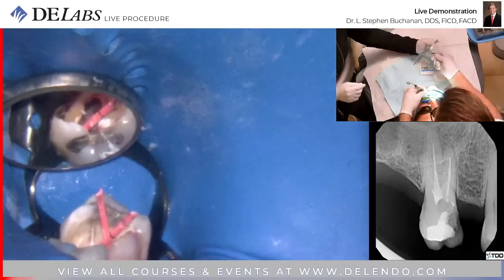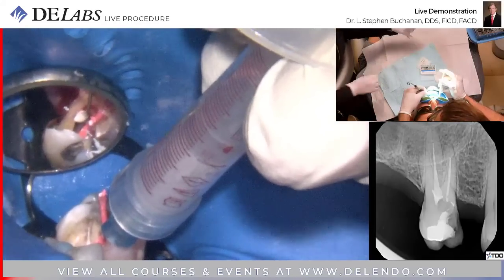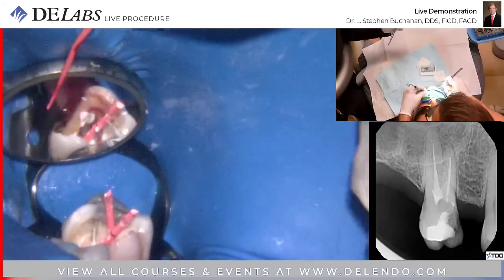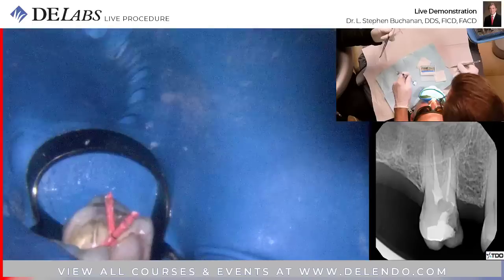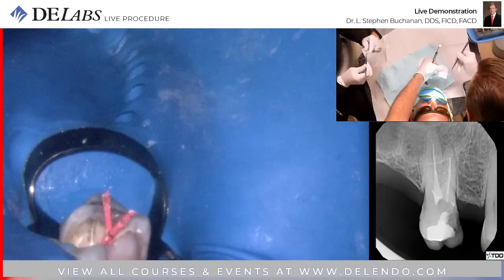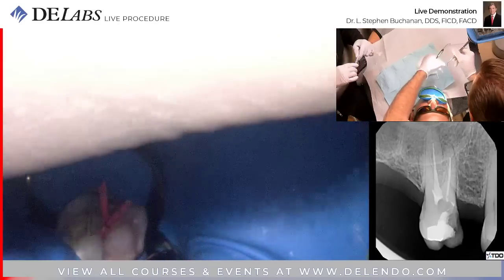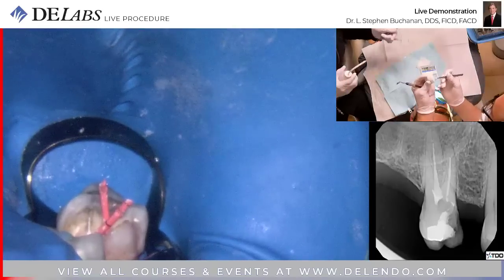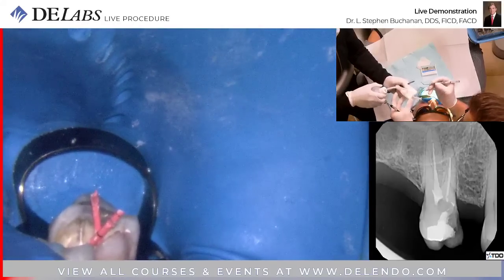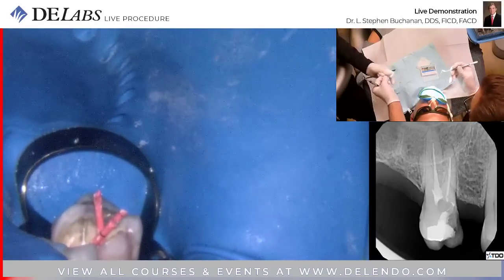Okay, sealer. You're not worried about necessarily getting it all the way dry? All the way what? Dry? This material sets in the presence of moisture. Not too much. If it's wet, it won't. If it's dry and just the moisture of the dentinal tubules, you're going to be golden. God, really? It's just this little. Okay. This looks like heck. Okay.